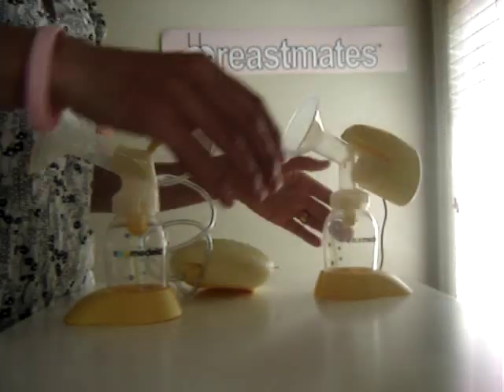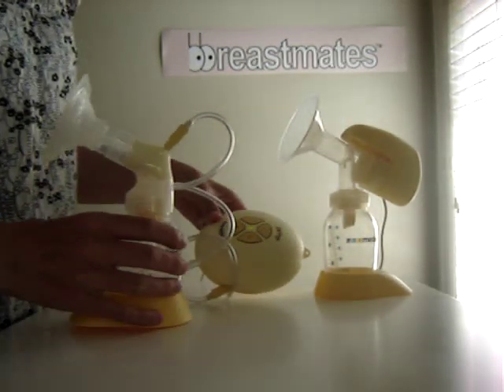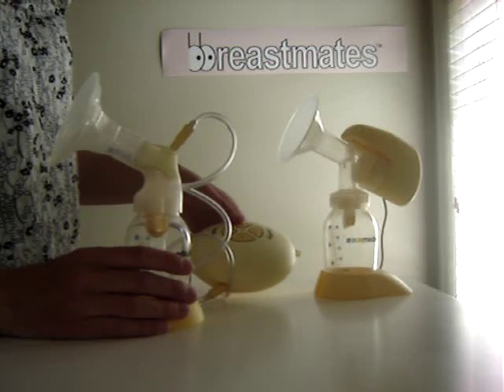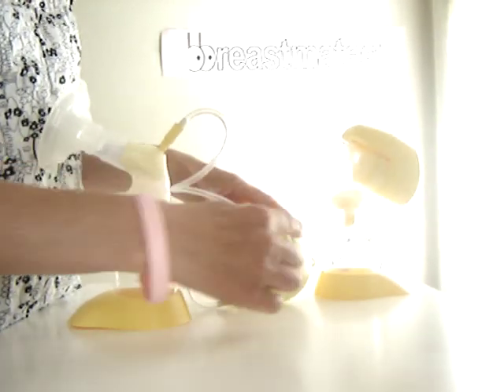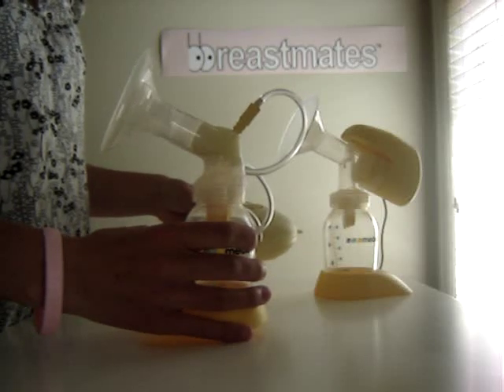And the Medela Swing Breast Pump. Just turn that on and you'll see the light flash. So this is first of all stimulating the fast sucking motion of a baby for milk letdown. And then we push the button with the two drips, and it goes to a much slower motion.